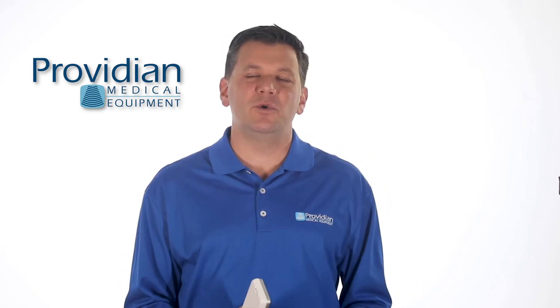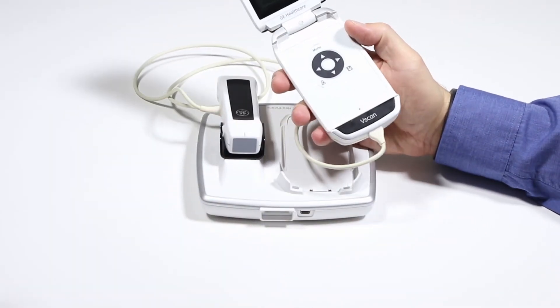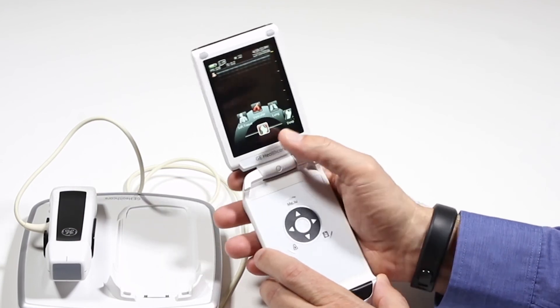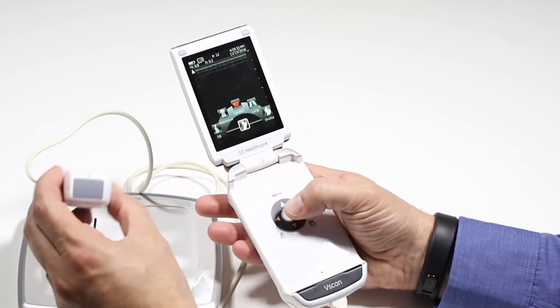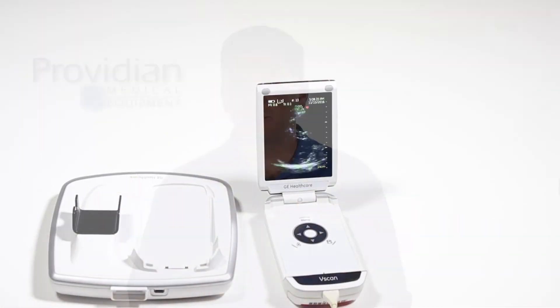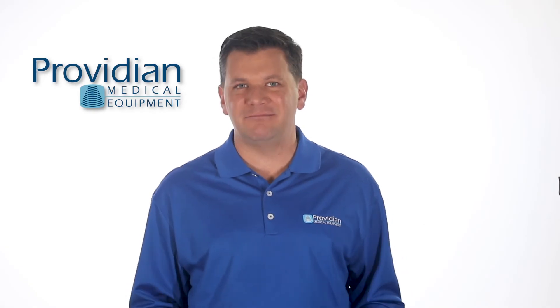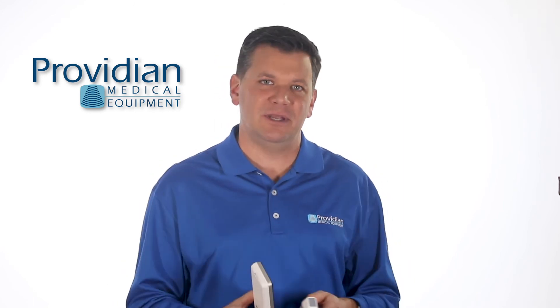For those of you coming from the previous model — the GE vScan Dual Probe, which is smaller and has a flip screen — you'll find the image quality to be about the same. The advantages found here are its larger screen, extra tools, Wi-Fi, apps, and the touchscreen interface. The image quality and speed between the two are pretty much equivalent; however, you can do a lot more with the apps and the touchscreen interface.